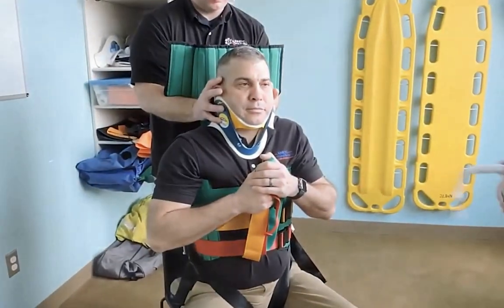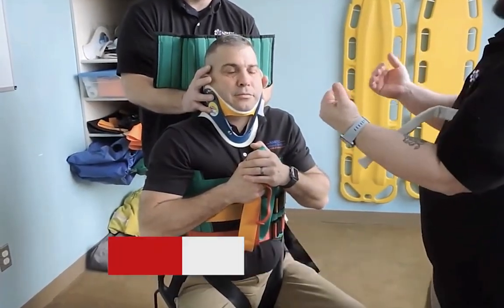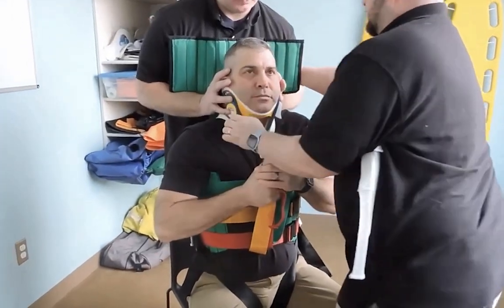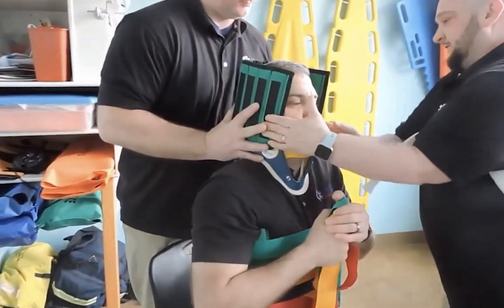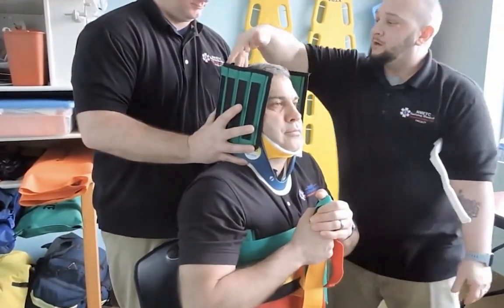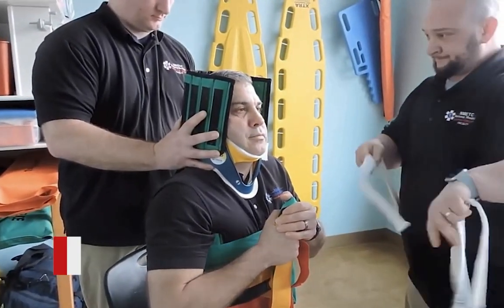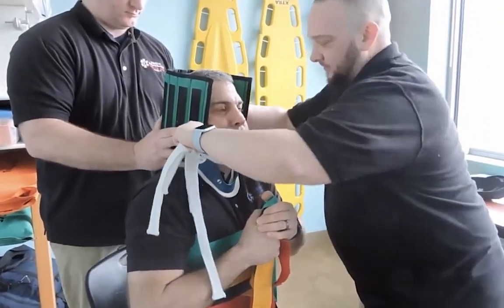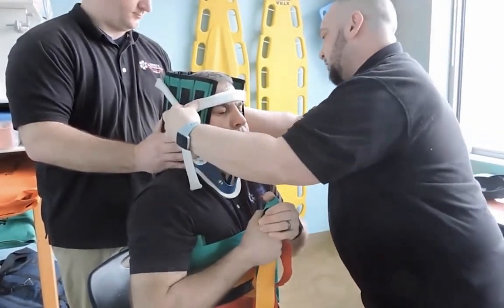What we're going to do now is work with my partner to secure the head. I'm going to secure the head flaps — you're going to slide your hand out and then place them over the head flap. Ready? Lean into the patient for me. I'm going to minimize the void, taking this side and this side. So we have not released C-spine, there are no voids, and everything's tight to the patient. I'm now going to secure with straps — coming under the chin, not causing deformity to the collar — and coming over the forehead.